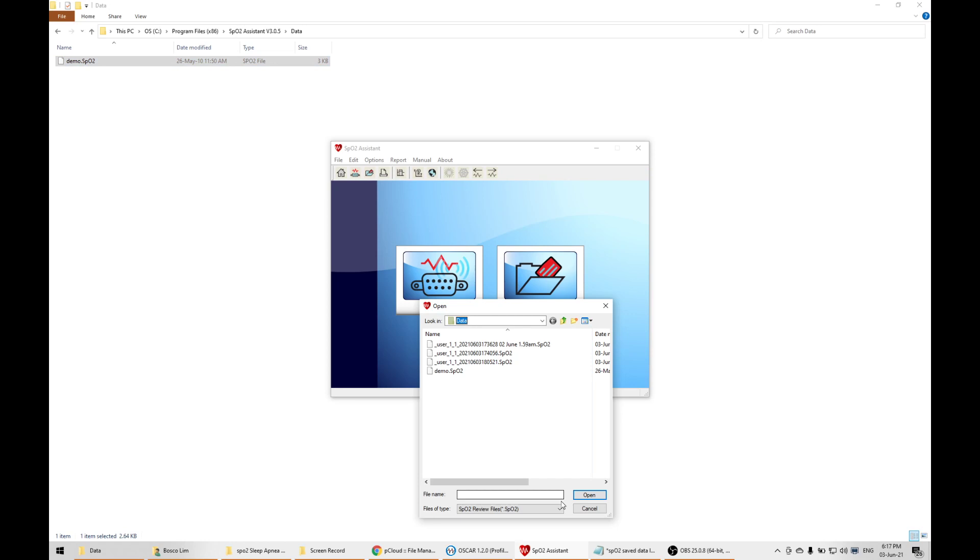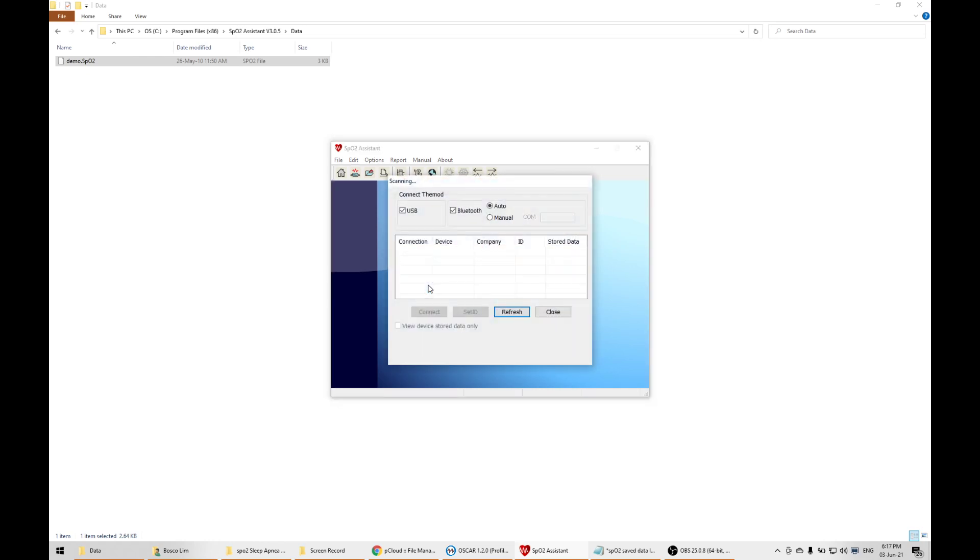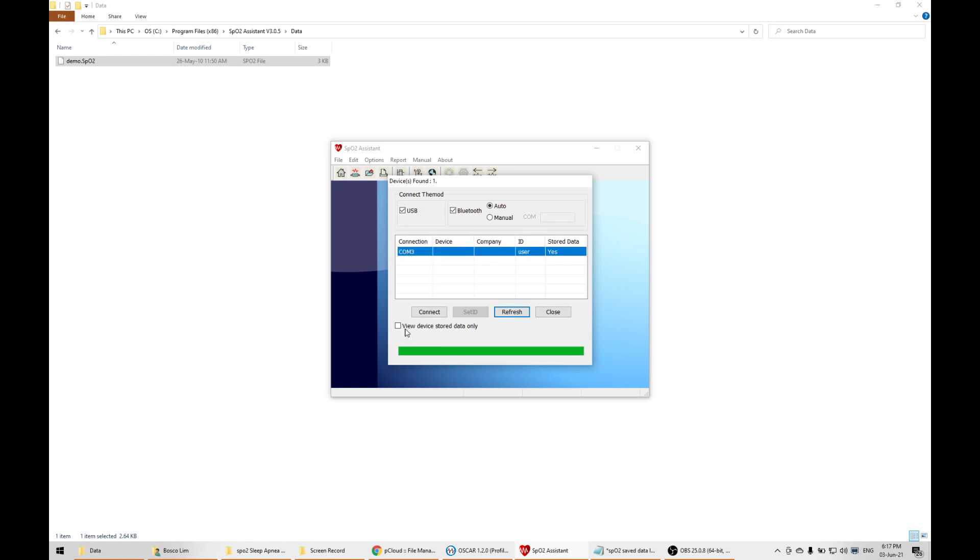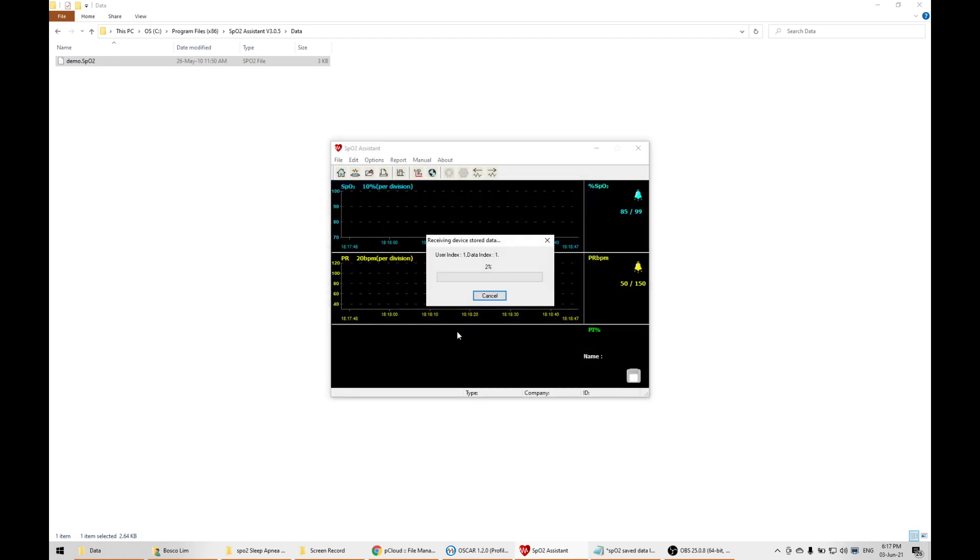I'm going to show you how to find these files, which are actually hidden inside a virtual folder. First, I'll show you how to download the data. On the CM50D Plus, press and hold the button to go into the menu where you can let it detect. Before that, drivers need to be installed, which you can find in other YouTube videos.